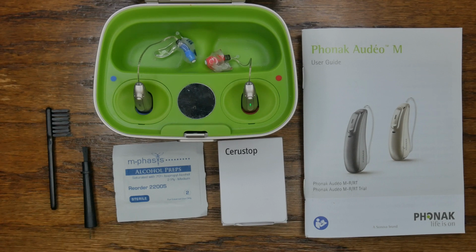When the hearing devices are placed into the charger, they automatically power off during the charging process. You will see a light begin to flash on the back of the device, indicating that the battery is being charged, as well as the battery charge level.